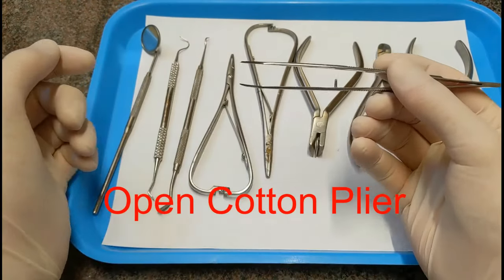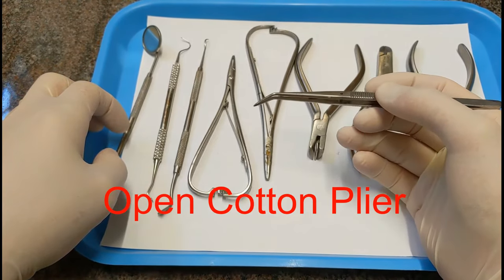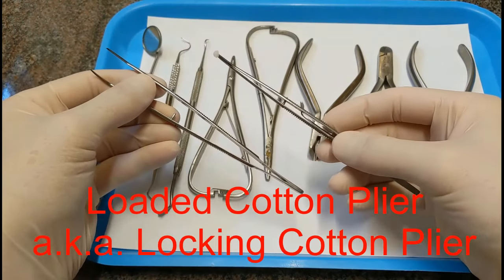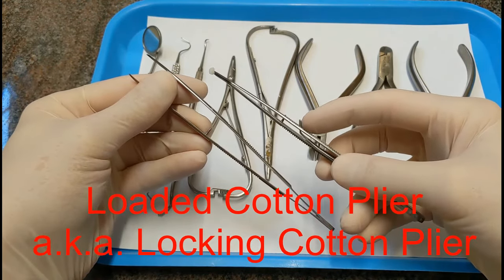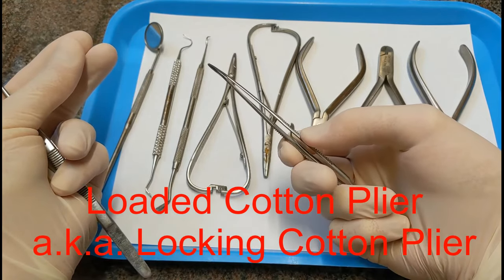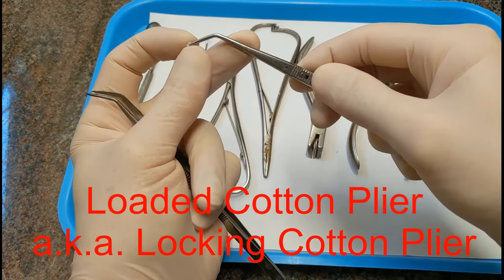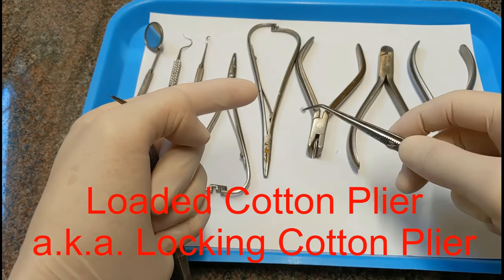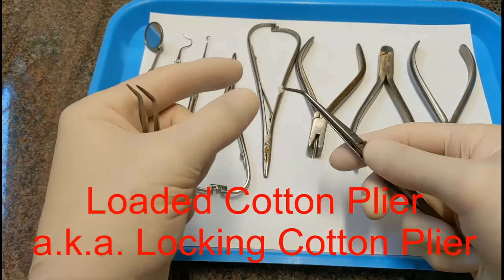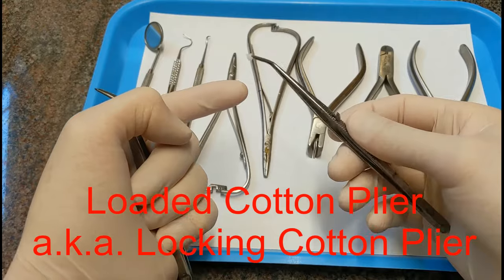This is called an open cotton plier. It's for taking cotton rolls in and out of the mouth, and we'll use it to hold retainer wires when placing them. It's different from this one, which is called a loaded or latching cotton plier, because this one has a little latch. When you push it closed, it latches shut. We use these to hold cotton ends, soak up liquid etchant, and apply it onto the tooth. When done, you unlatch it, throw the cotton away, clean it, and grab a new one after sterilization.